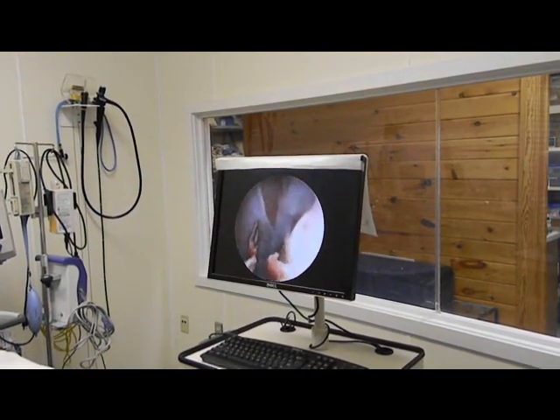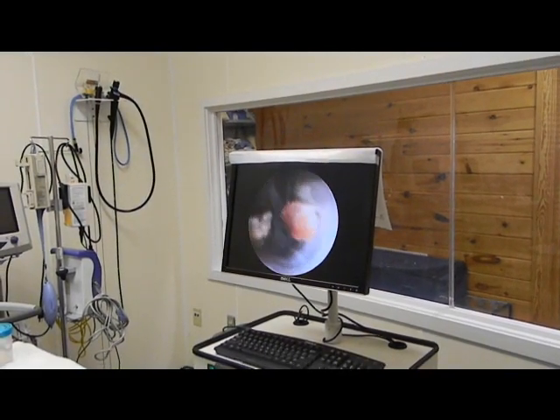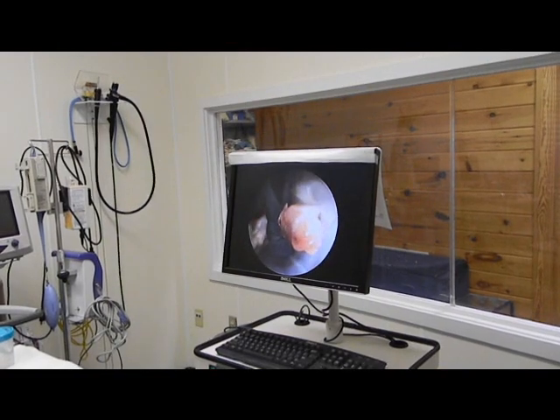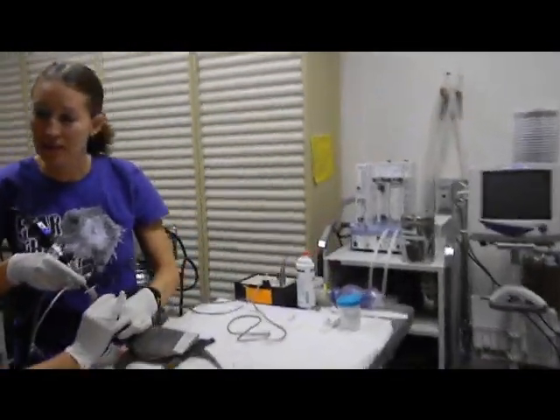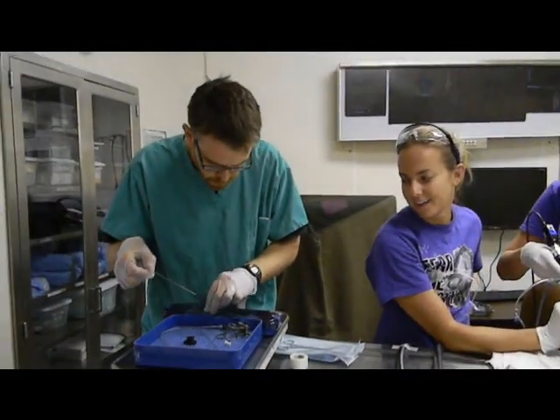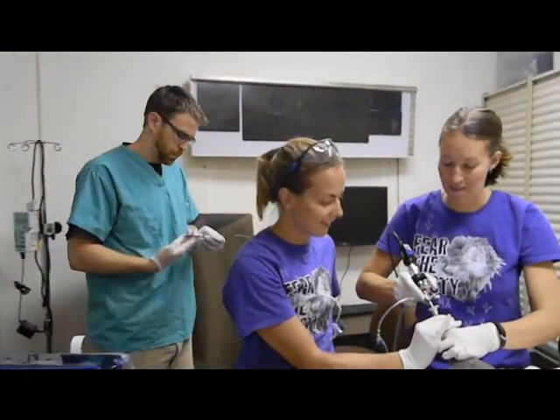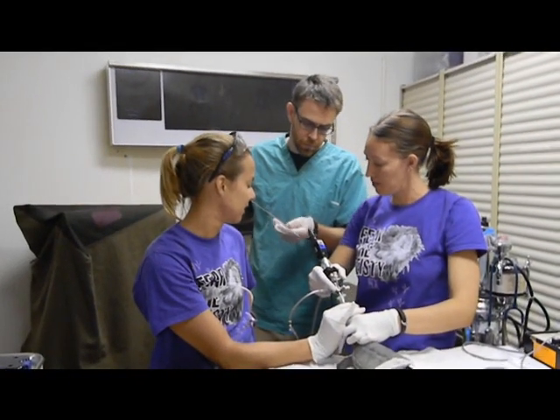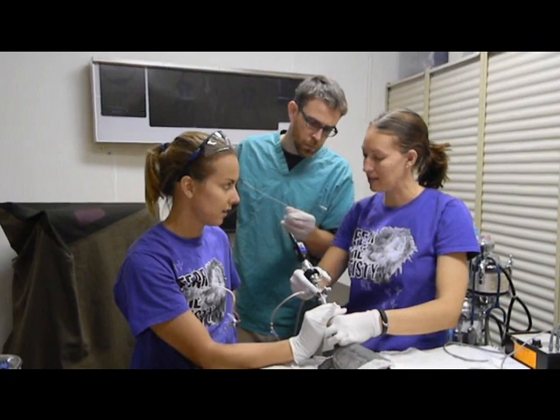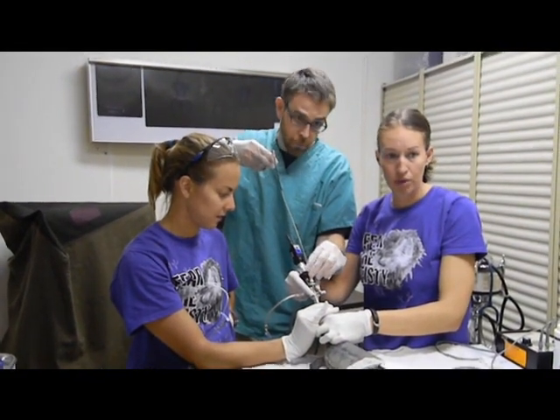Let's do something fun for the audience — we're going to try to pull these things out. Rich, can you grab the little graspers out of the — I think they're the far right ones? Usually I end up trying to do all the graspers by myself, but this will be fun. So I'm going to open that up and then hold it right down at the very tip and then feed it through, because then we have these little tight rubber stopper things and they kind of hold things really funny.